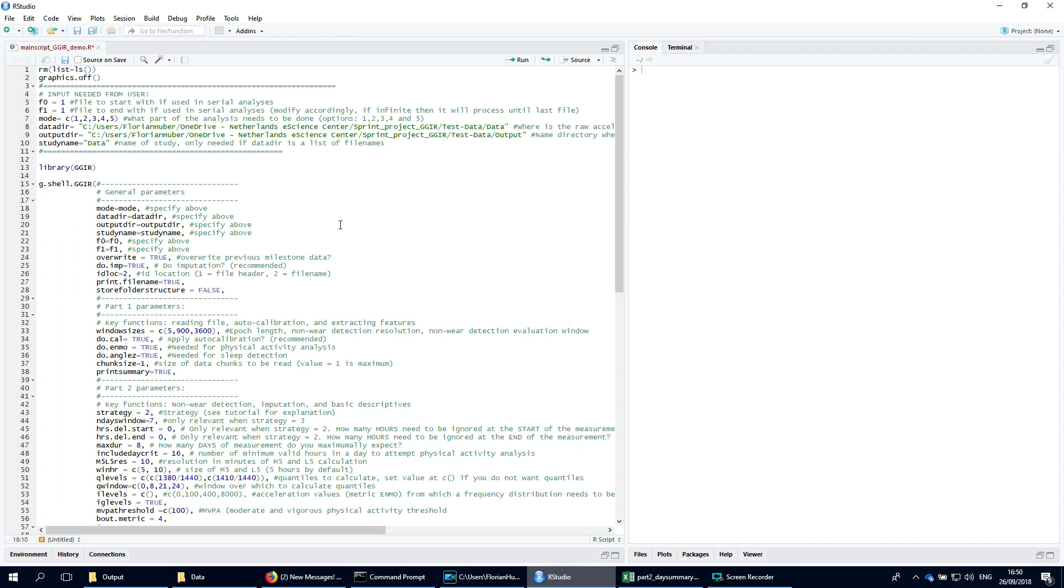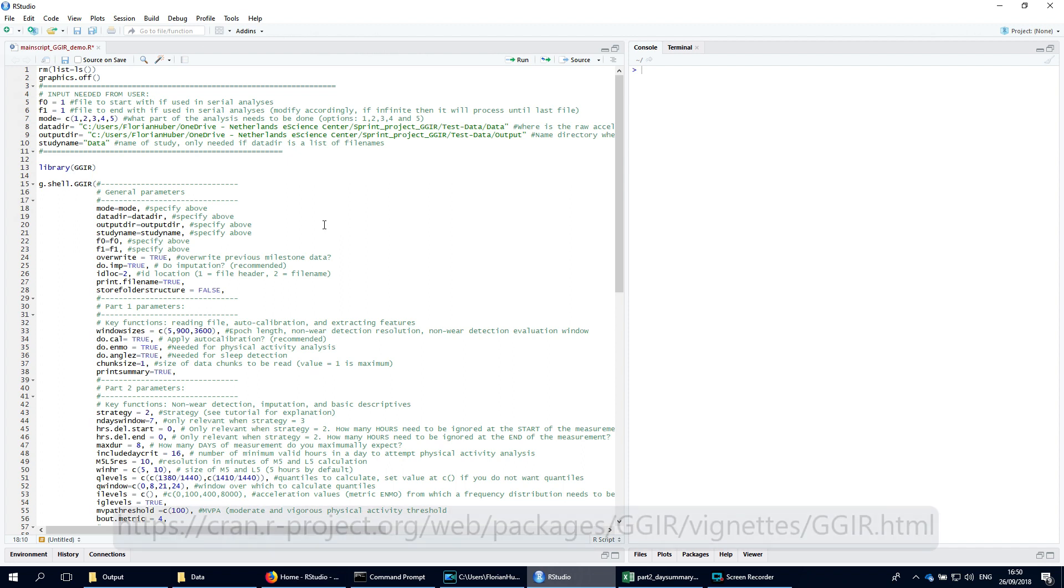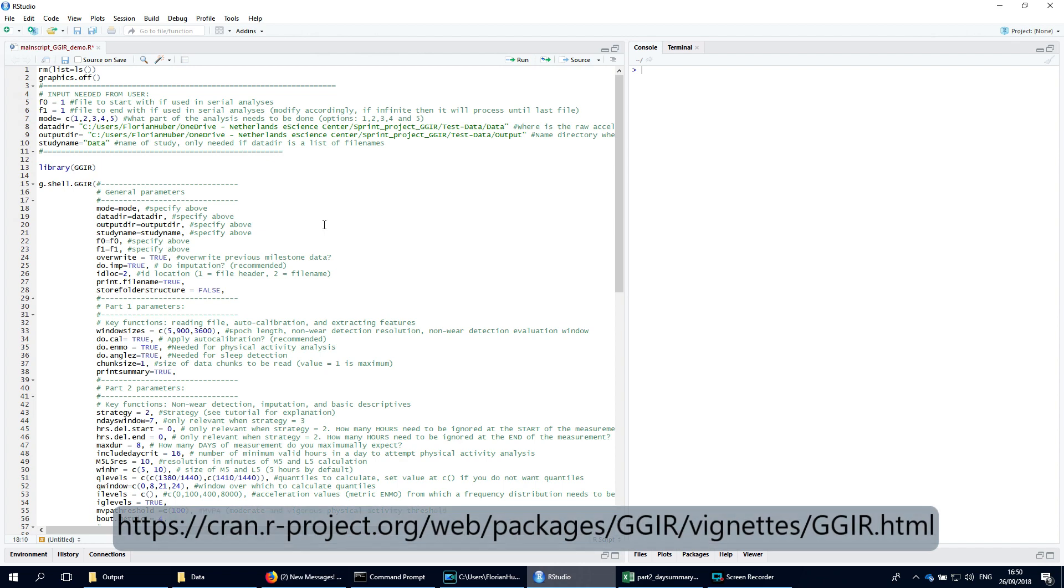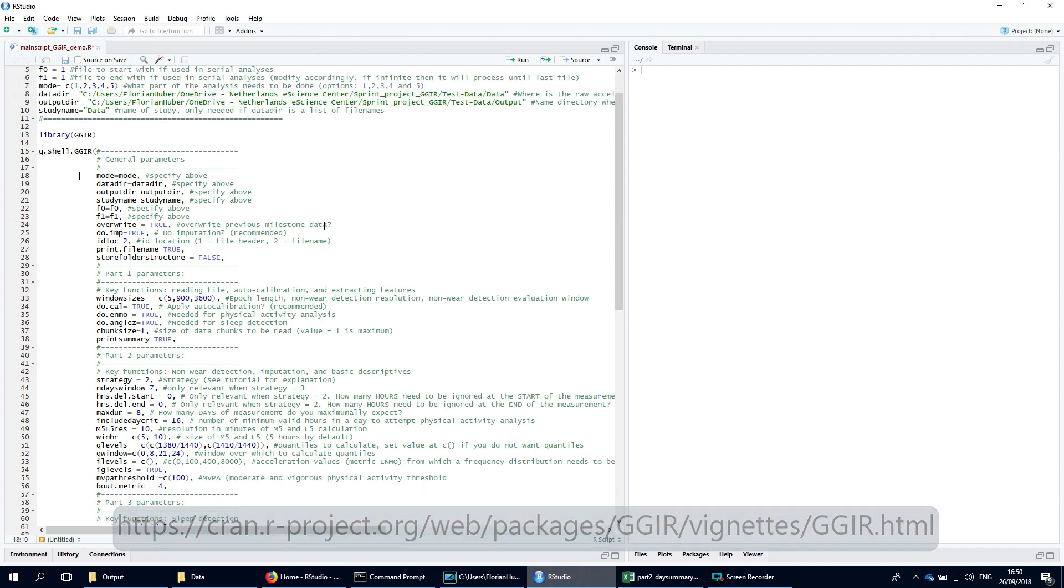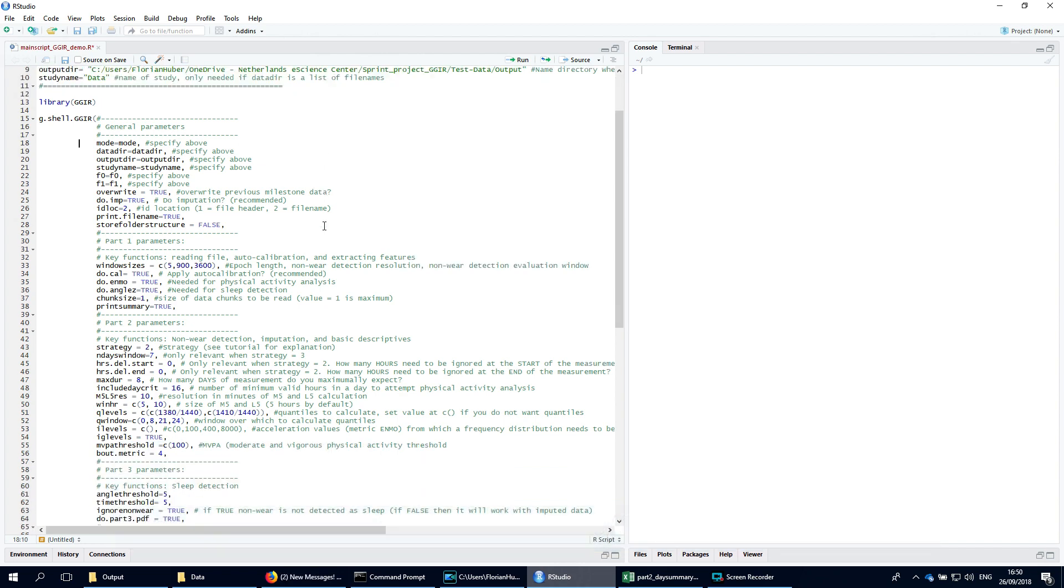What you see here is an example script for using the shell function. You can find a copy of this in the package vignette. The lines represent the function arguments. If you remove a line, the default argument value is assumed.